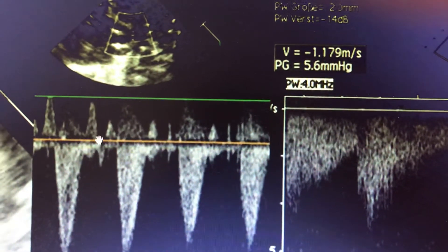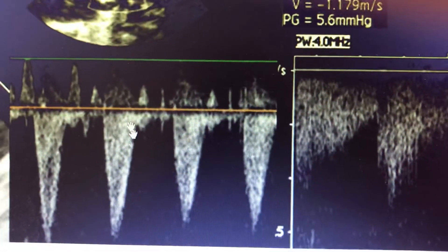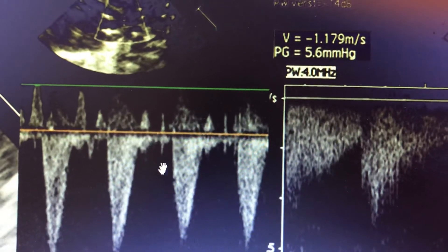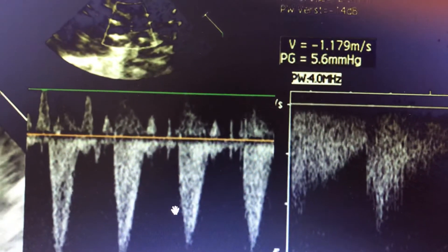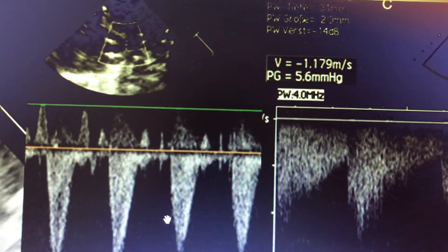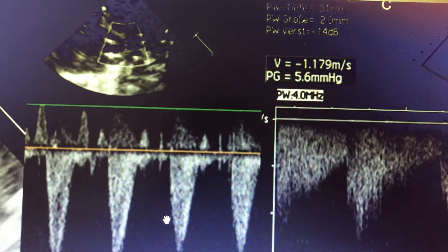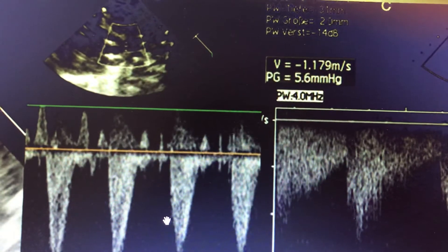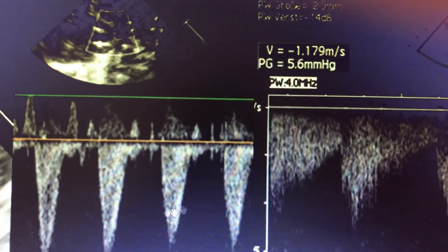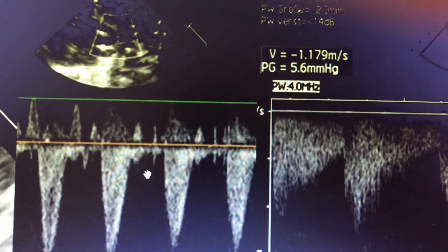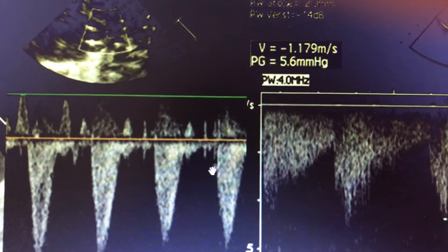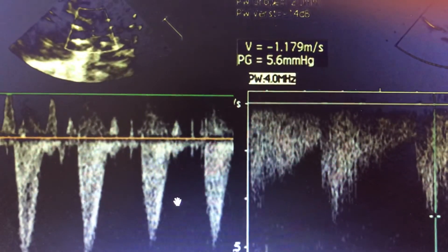But here there is a right-to-left shunt, so most of the blood is getting away from the pulmonary circulation. There is also no diastolic flow. Most probably this is a case of very early — immediately after birth — where the pulmonary pressures are still very high and not yet reduced. Or it is Eisenmenger syndrome, where there is only systolic flow away from the pulmonary artery and no diastolic flow, indicating suprasystemic pulmonary pressure.